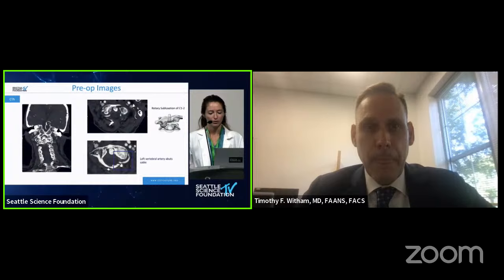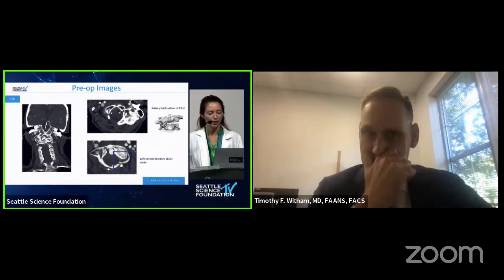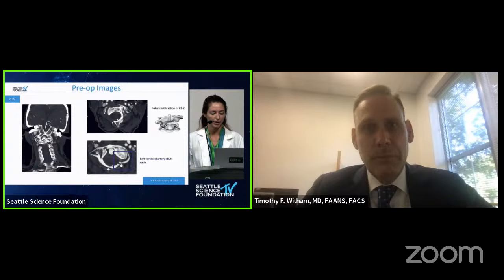So I interrupted Dr. Cicino rudely. Can you just quickly point out again what we're seeing here, and then continue before we interrupt you again and ask Dr. Witham for his salvage suggestions? Basically the patient has a rotary subluxation of C1 on C2. One of the main concerns is that when this deformity occurred, we saw on the CTA that her left vertebral artery is abutting the cable.